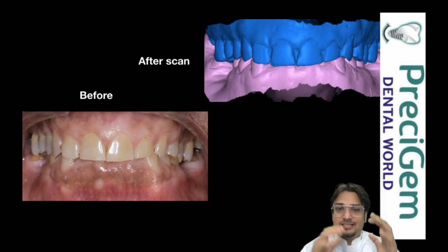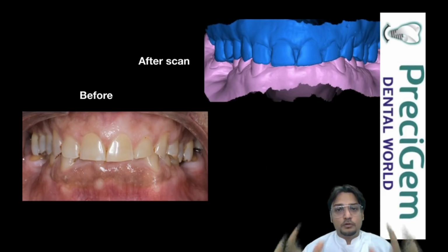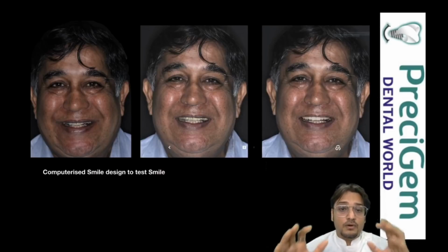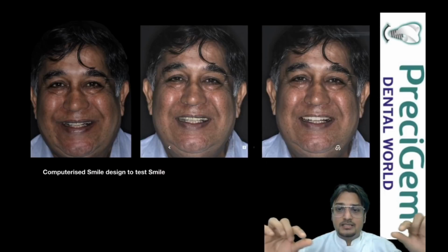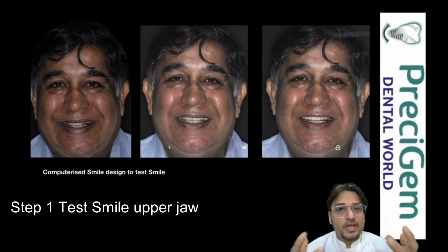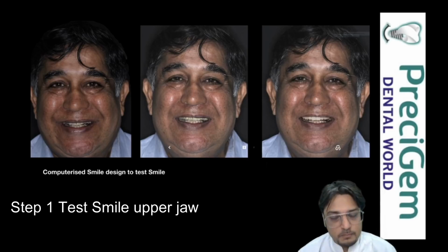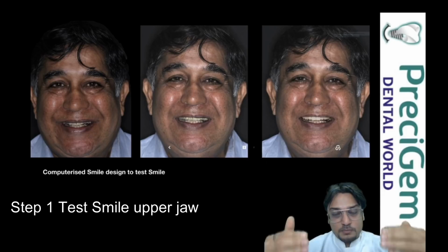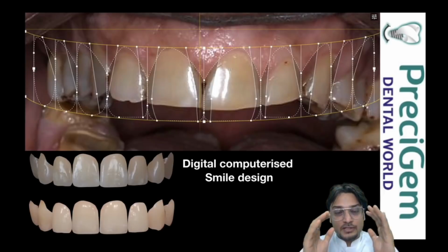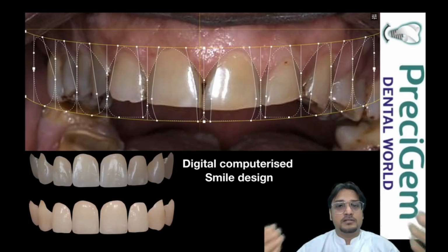Usually after the scans, meaning we take the impression, the models are prepared, the models are scanned and the scans are transferred into the computer. So what you see above me is a scan of a patient in the computer. Then, on the computer, a digital smile design is made only on the upper jaw, just to test the smile. The way you go to buy a new car and do a test drive, similarly this is called a test smile, where we design your smile on the computer and then transfer that smile into your mouth before doing anything. So you come to know the approximate results in future.